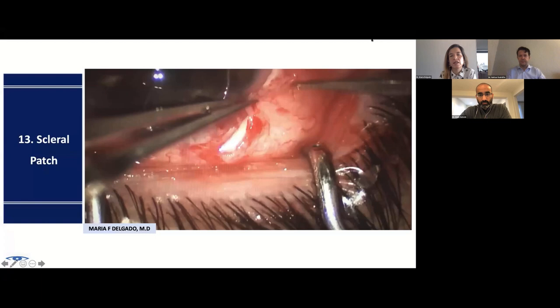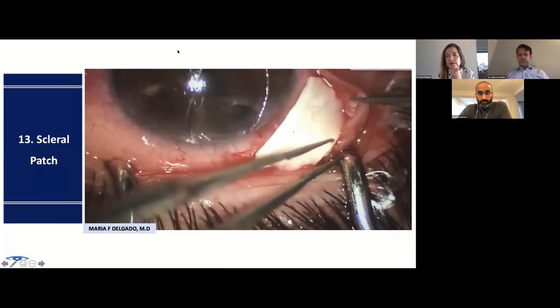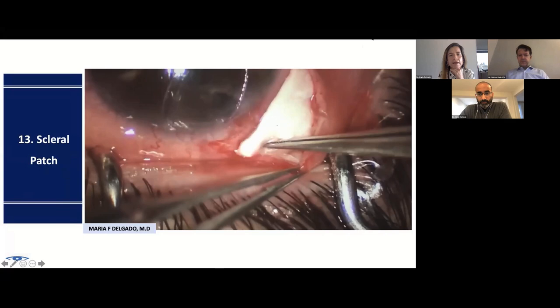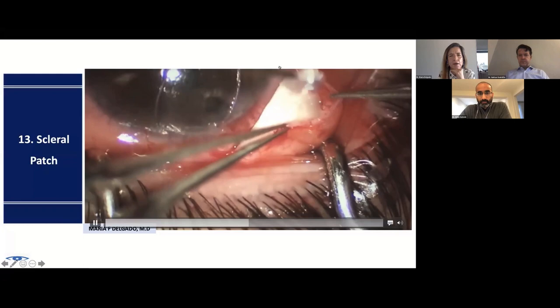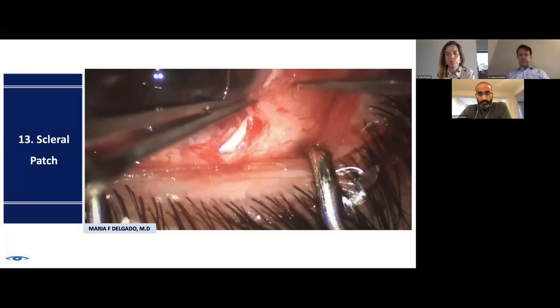And to cover it, I just throw two nylon sutures, hiding the knots below the patch. I don't have any issues thinking that it may make the scarring process worse. Some people say that they don't use it, not only because of the extra time or the little availability, but also because of the scarring process. What do you do, Nate, for your patch?